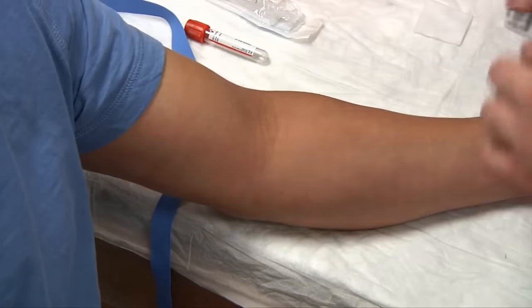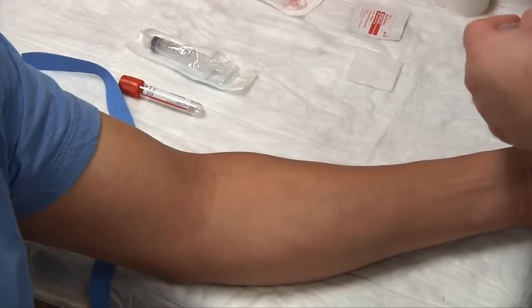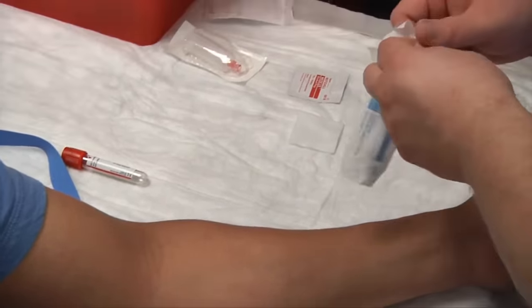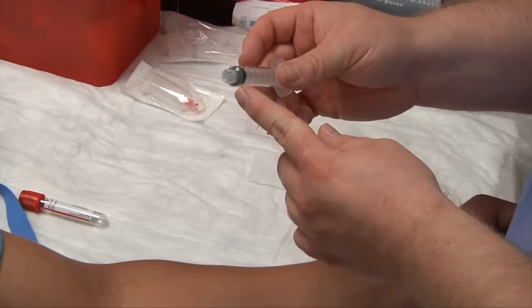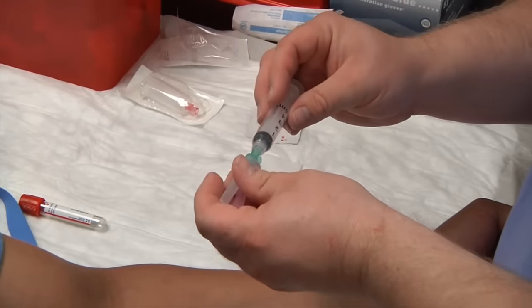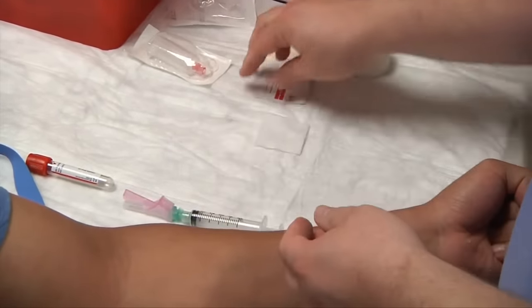Assemble our needles. Make sure that the needles and syringe are in date — if expired, the needle and syringe would no longer be sterile. With our syringe, you'll see there's a luer tip. 'Luer' means thread, so we can thread this on like a screw. Make sure it's good and tight.